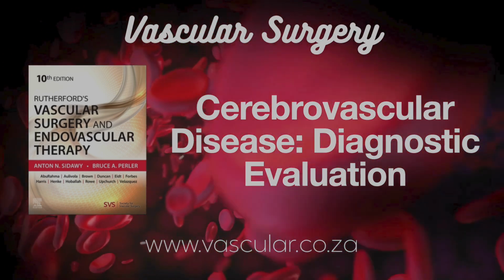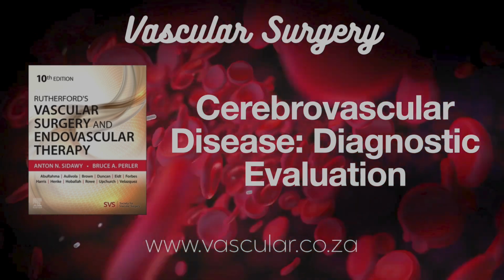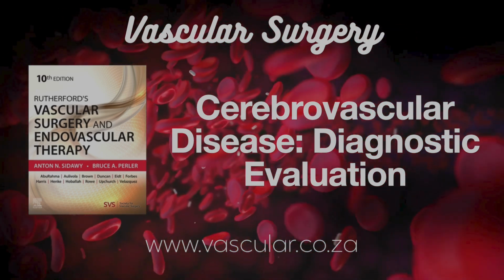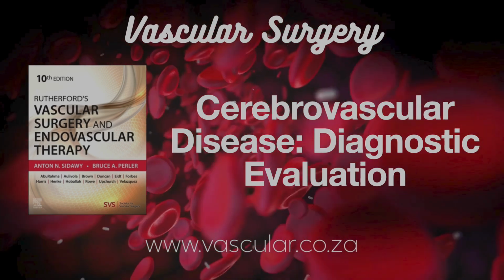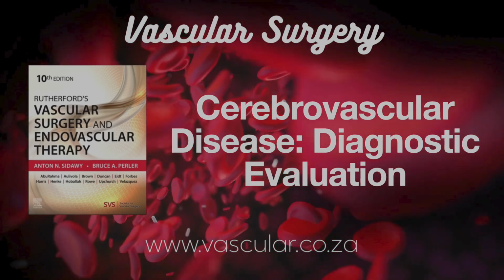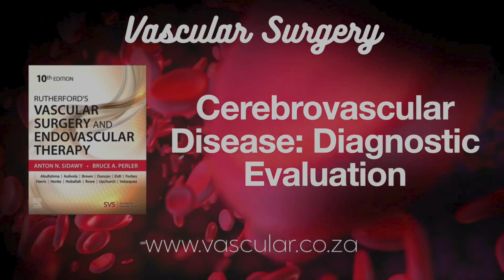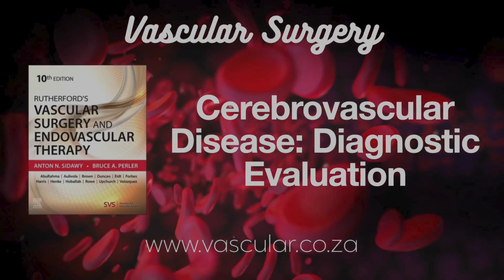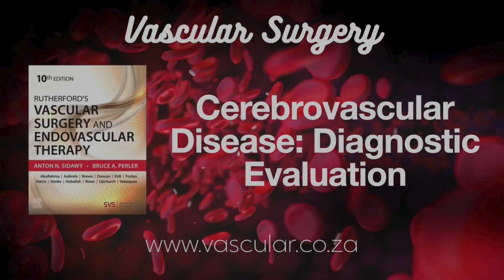What about CT and MRA? MDCTA is already good at spotting ulcers in the plaque, which are a risk factor. And MRA, despite its limitations, is proving useful in research for visualizing things within the plaque, like internal bleeding, intraplaque hemorrhage, thrombus, or a ruptured fibrous cap. These features are strongly linked to plaque instability and stroke risk.